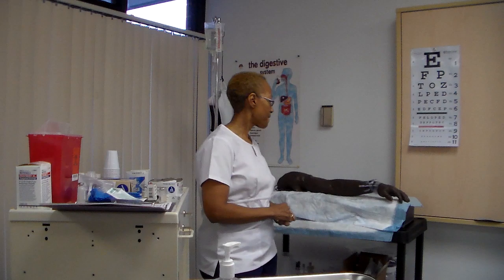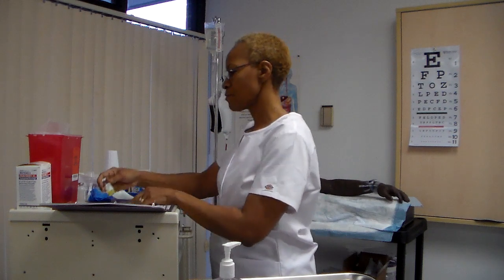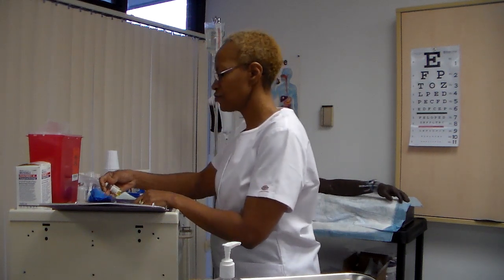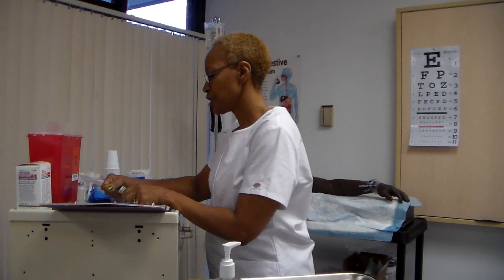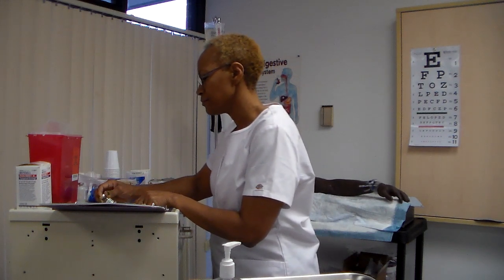Prepare ordered medication from vial or ampule using aseptic technique. First check. Check label of medication carefully with MAR. Second check. Okay, so first you check your medication as you're taking it out of the drawer. That's your first check compared to your MAR. Make sure you check your expiration date.